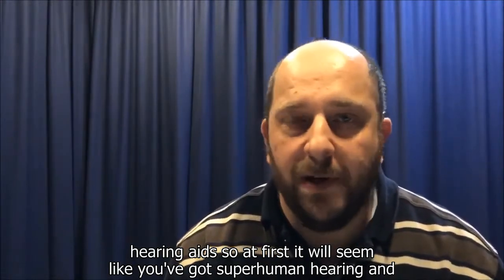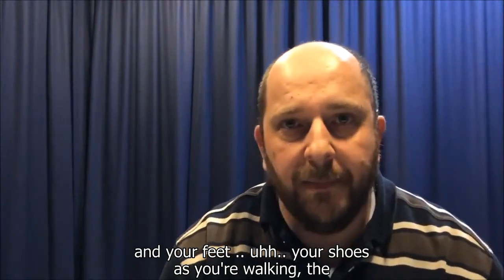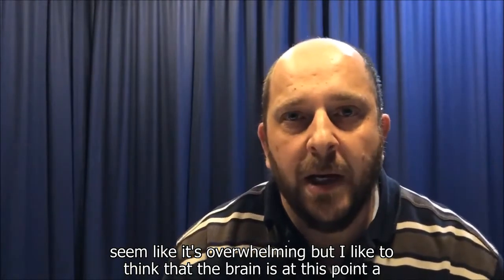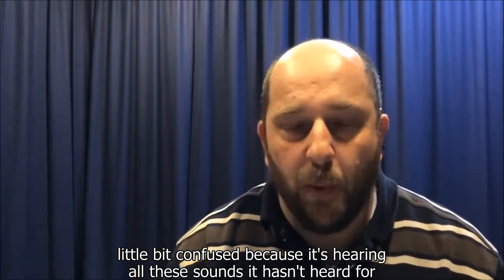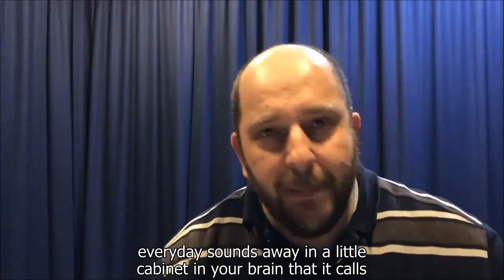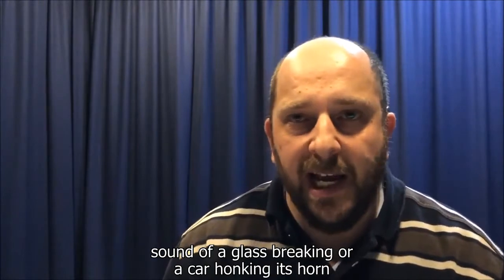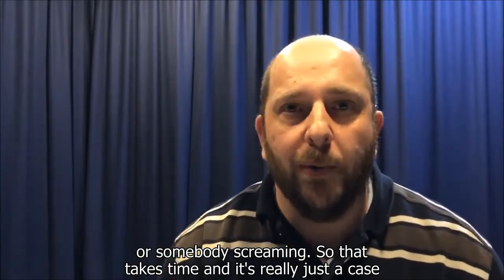At first, it will seem like you've got superhuman hearing, and you're picking up the sound of you scratching your head, your shoes as you're walking, the sound of taps dripping, all those sounds. At first, that can seem overwhelming. But I like to think that the brain is, at this point, a little bit confused because it's hearing all these sounds that it hasn't heard for quite some time. It's almost like it needs to mentally file all these everyday sounds away in a little cabinet in your brain that it calls needless background noise. You do want to hear those sounds, but you don't want the brain to react to them in the same way that it would if it heard a glass breaking, a car honking its horn, or somebody screaming.